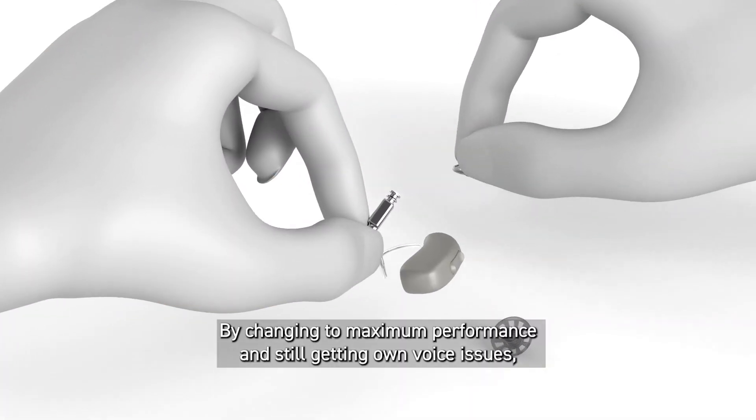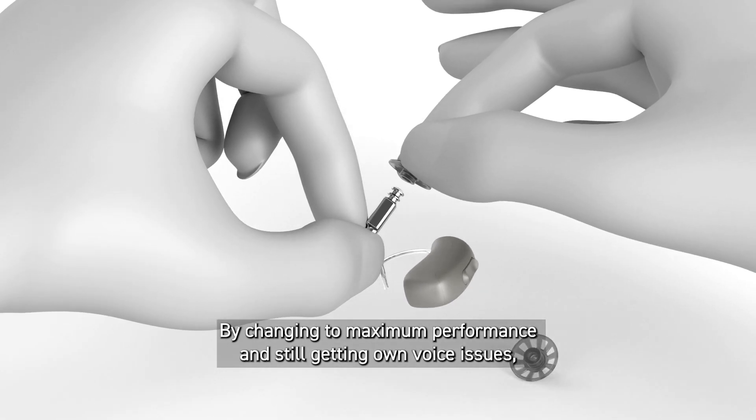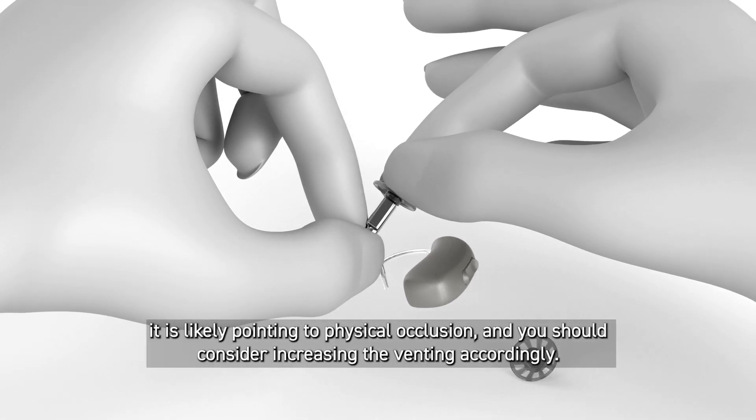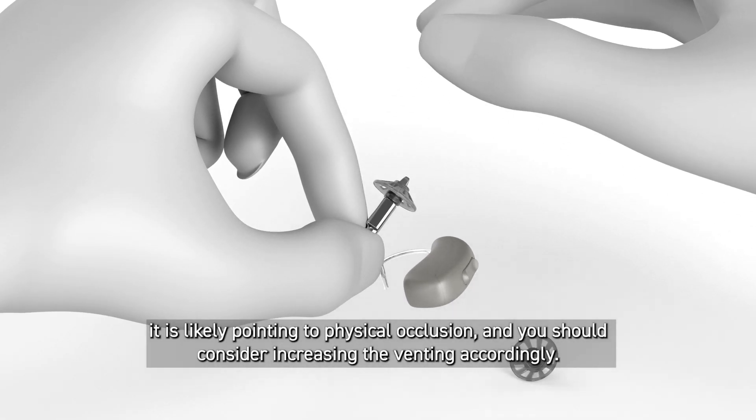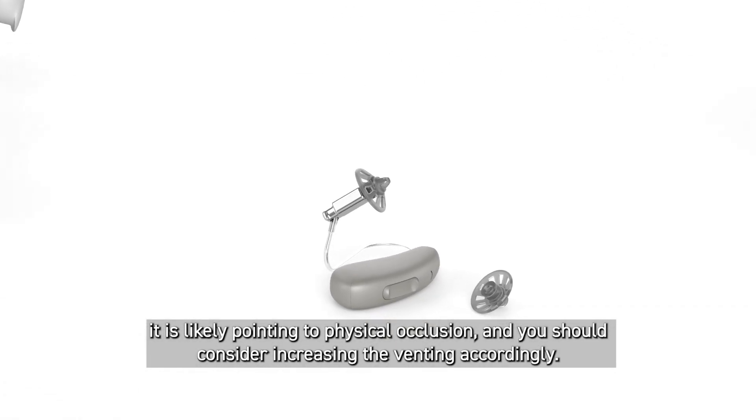By changing to maximum performance and still getting own voice issues, it is likely pointing to physical occlusion and you should consider increasing the venting accordingly.